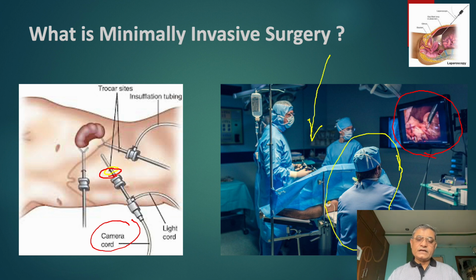Then, depending upon the necessity, he passes a few more instruments through small holes. This is the laparoscopy setup.